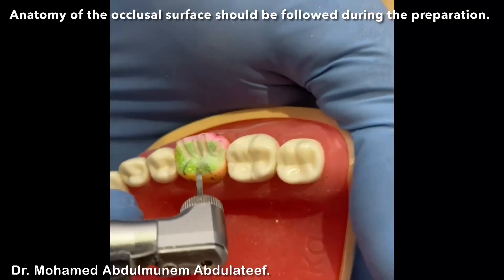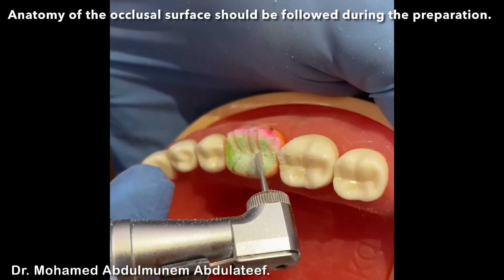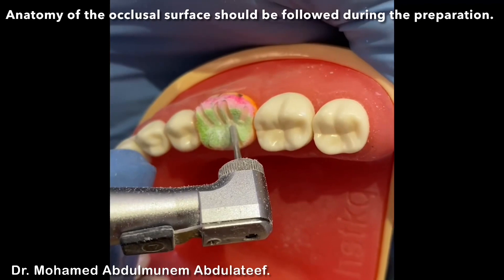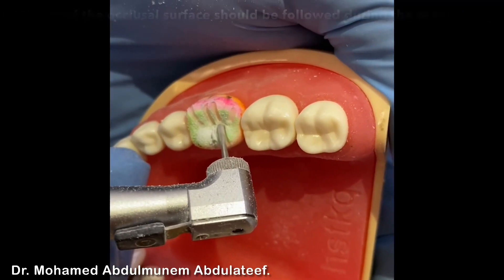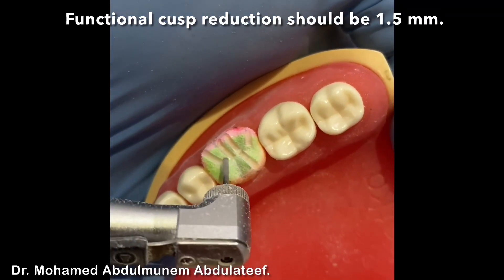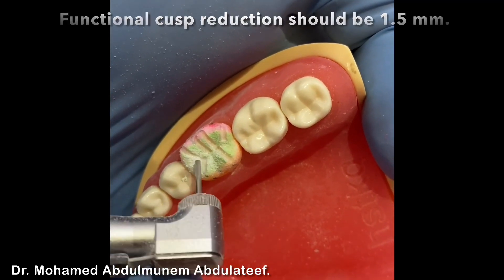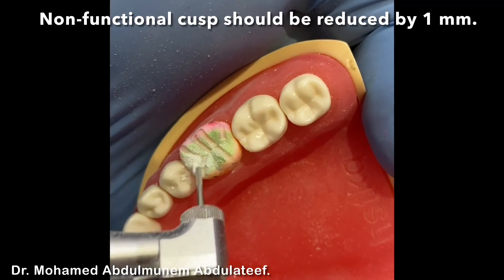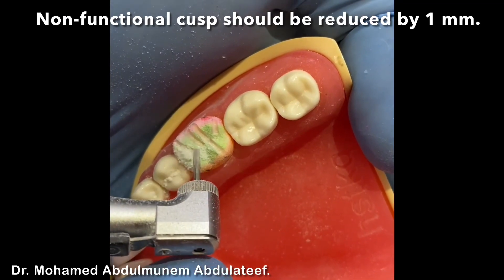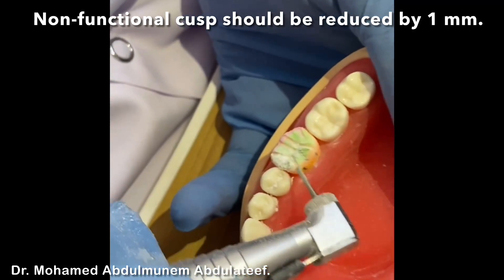Same with the lingual, following the inclination of each cusp. For non-functional cusps, the reduction should be about one millimeter for metal crown. For functional cusps it should be about 1.5 millimeters. For the axial wall it should be 1 millimeter for all axial walls. Our finishing line should be 0.5 millimeters.